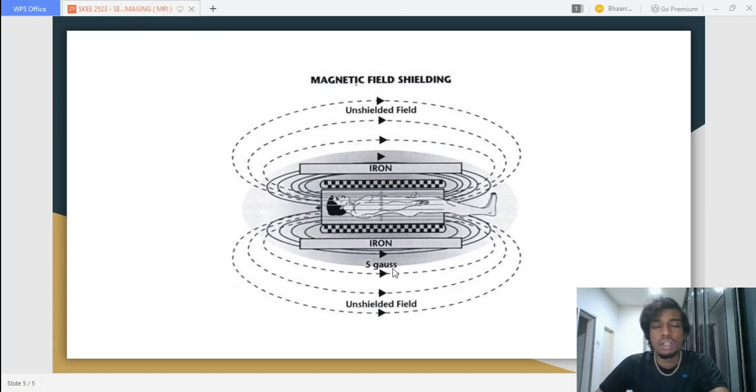An MRI scan is actually a machine that forces protons in the body to align with the field. The protons come from the hydrogen atoms, which have a single proton, in our body. This is where the magnets attract the protons to align to show the scan in the body. When a radio frequency current is then pulsed through the patient, the protons are stimulated and spin out of equilibrium from their current state, straining against the pull of the magnetic field in the body.